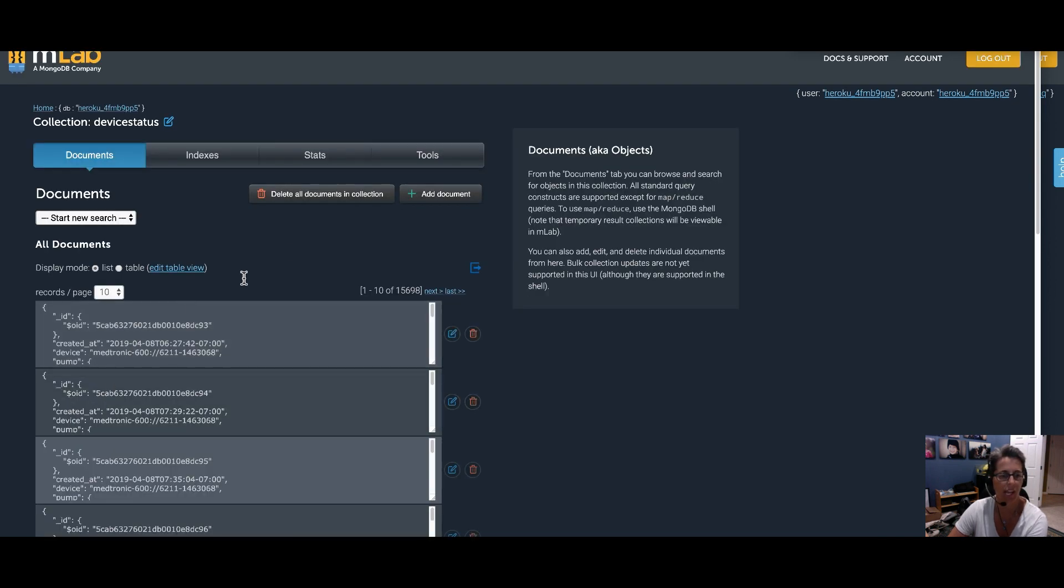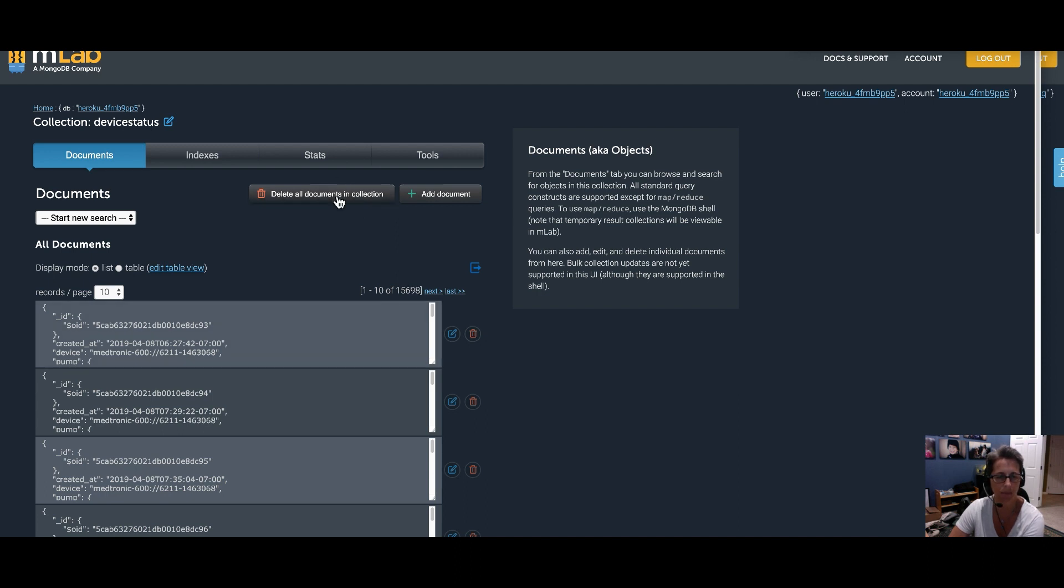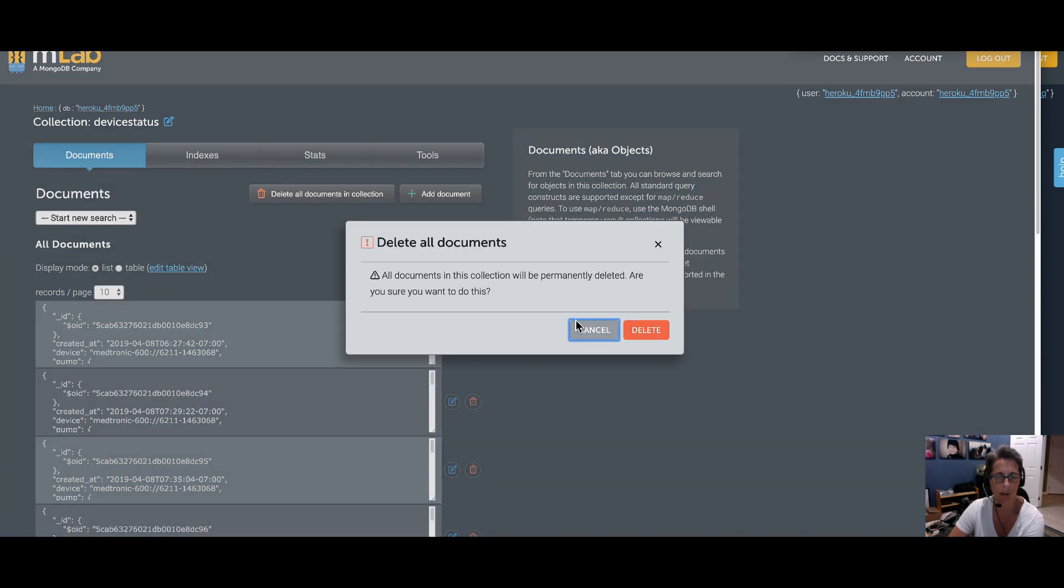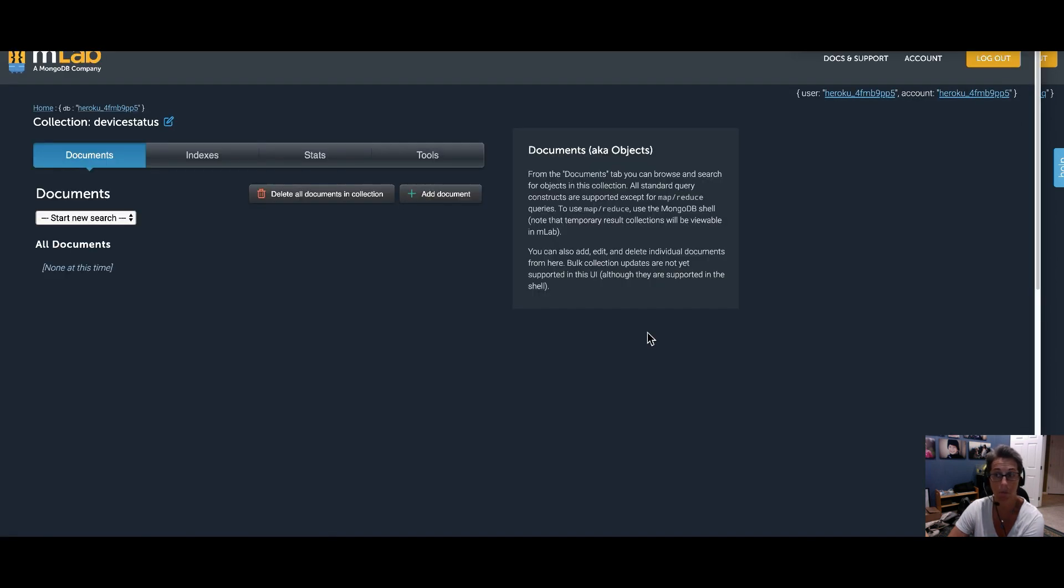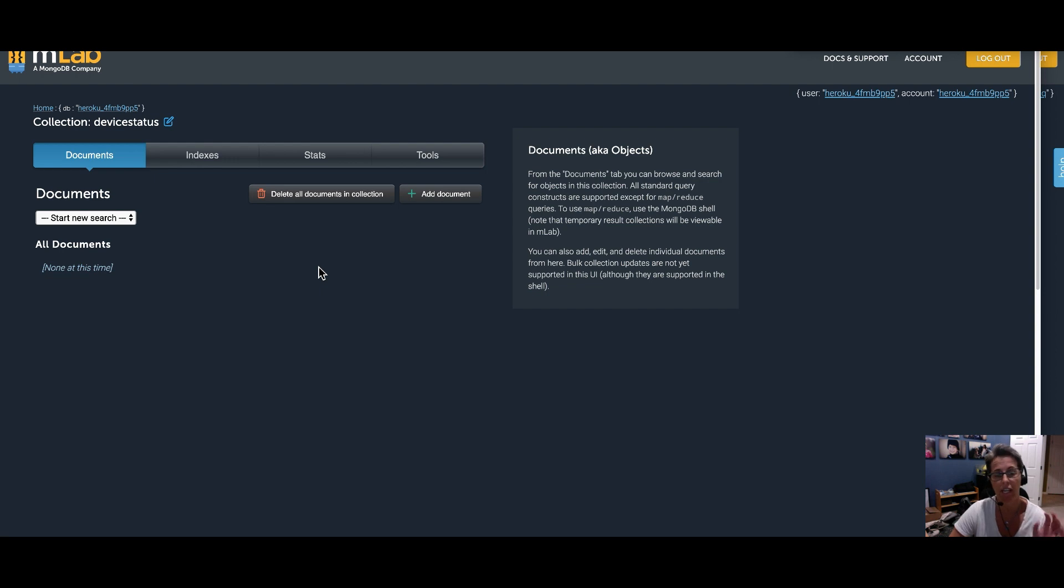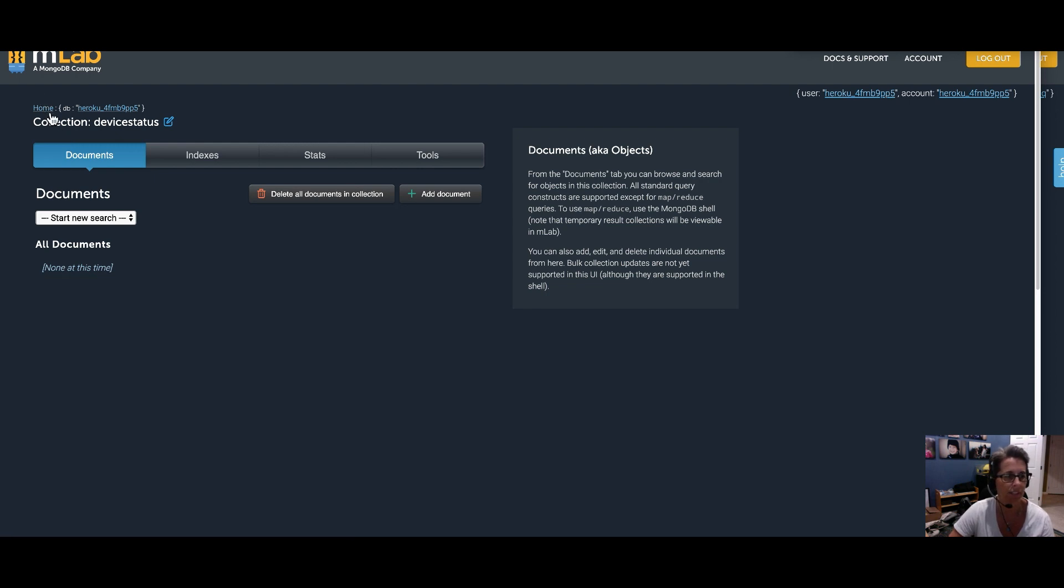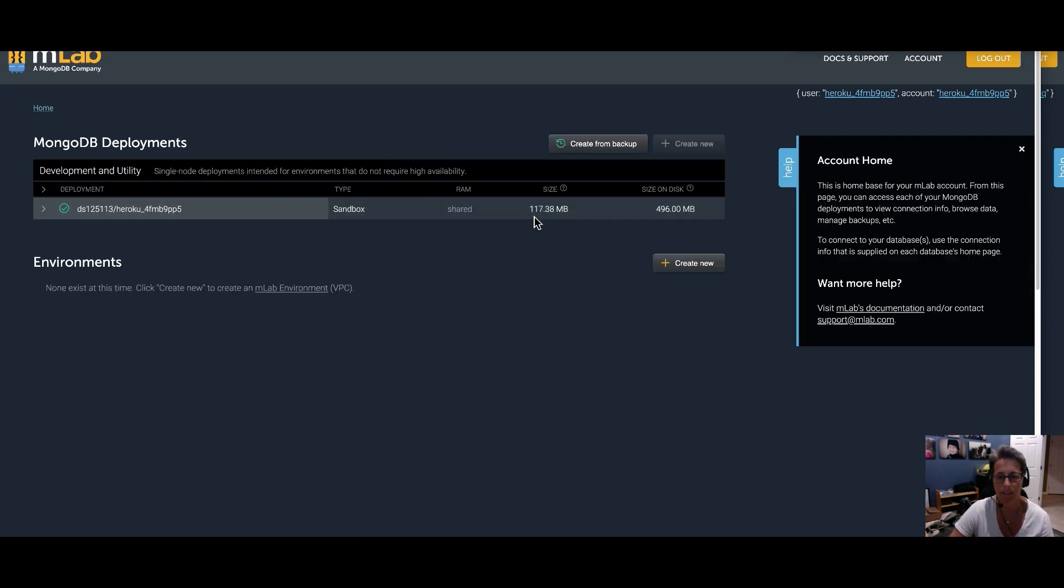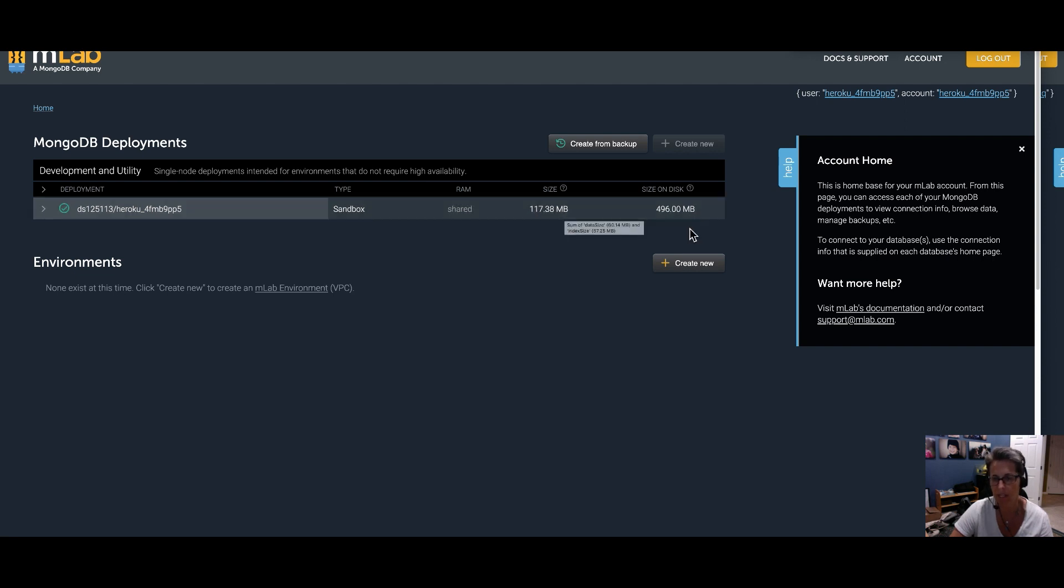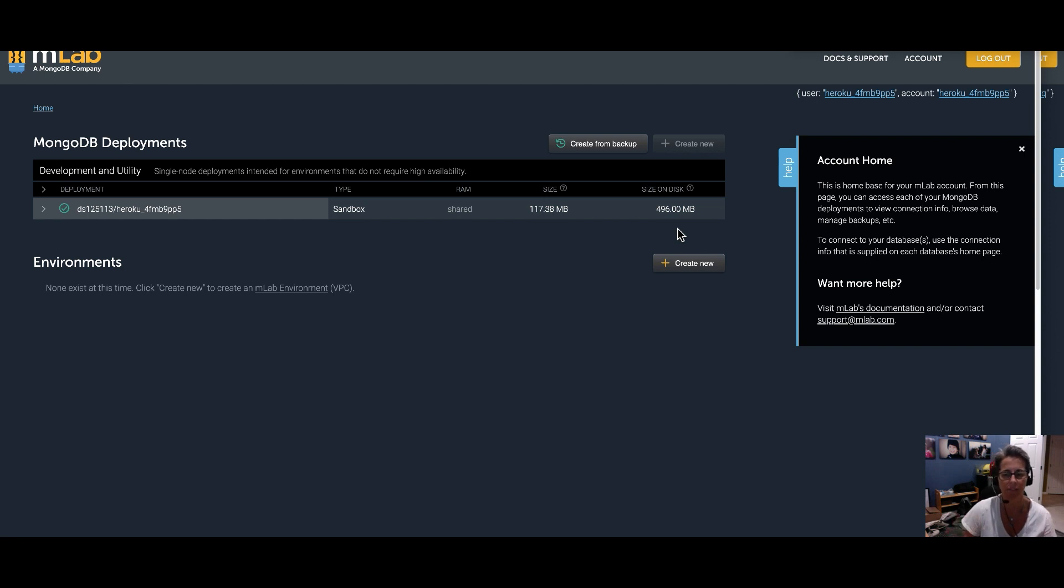And we're going to click on the delete all documents. There are 15,698 documents, we're going to delete them all. Generally speaking, MLab doesn't do a good job of cleaning all of these out on the very first try. Oh, we got lucky! Yay! Okay, so it deleted them all on the first try. If all of them did not delete on the first try, go ahead and just keep deleting until that 15,000 number gets all the way to zero. So now we've cleaned out size, we're down to 117 megabytes. That's great. But our size on disk is still precariously high to that 500 limit, and we want to shrink that down.